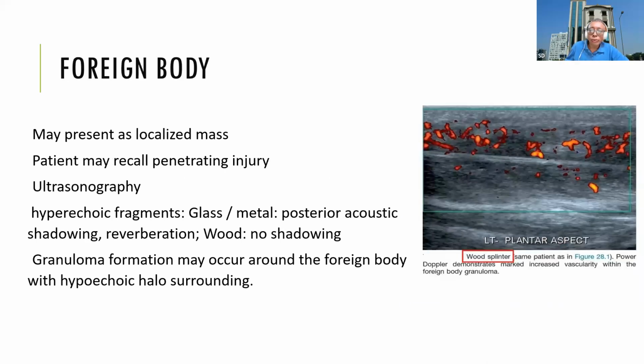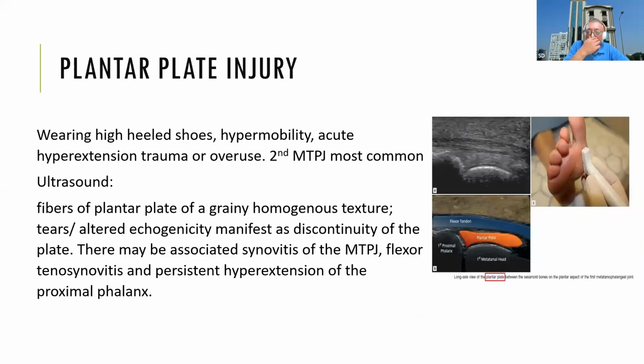Okay, so another problem that can be associated with the foot is plantar plate injury. I think we have already studied the plantar plate in the hand. Plates are usually between all the joints.